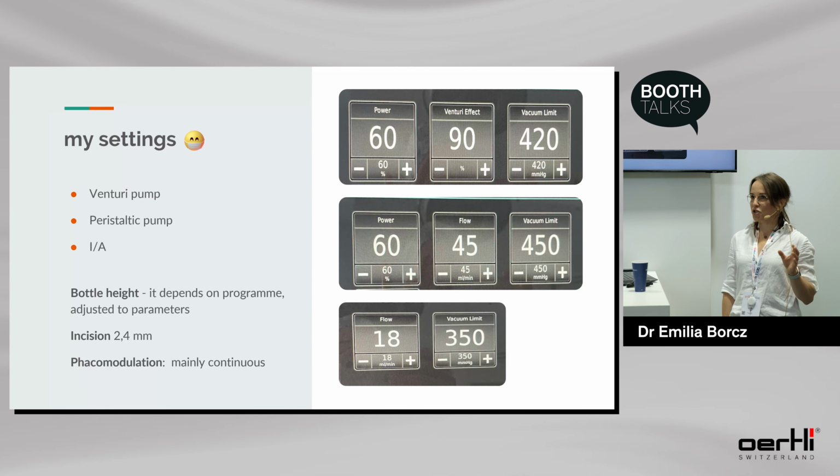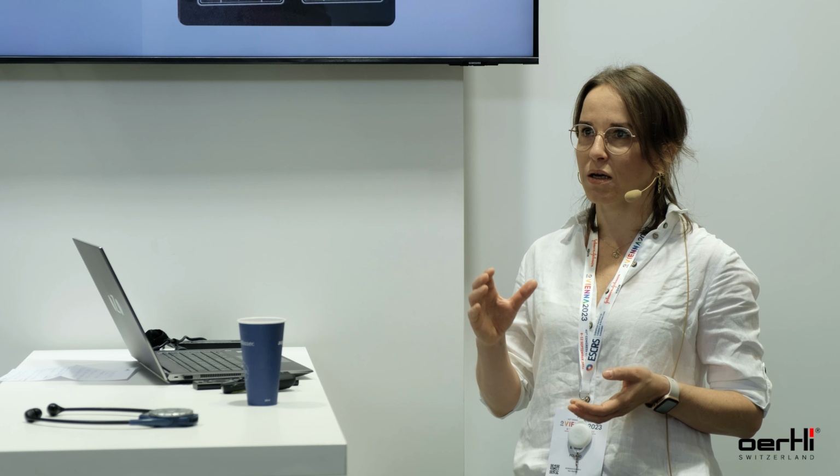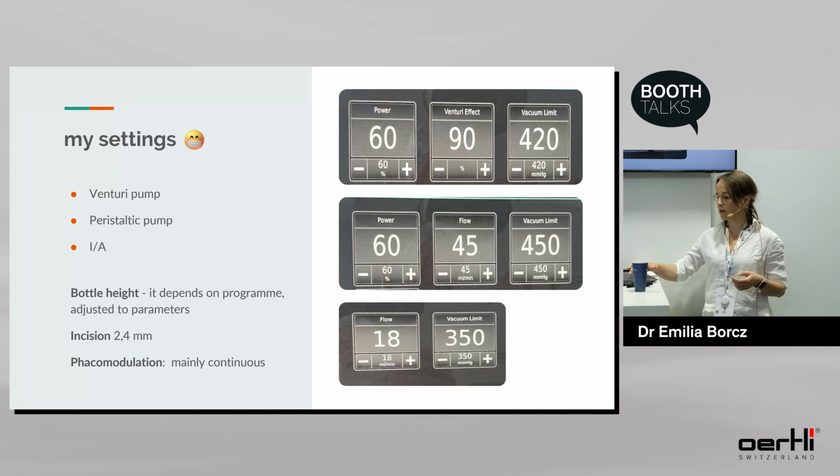The bottle height I adjust to the situation, to the program, to the lens. For sure, the intraocular pressure is not too high. It does not destroy endothelial cells, but is good enough to protect from collapsing. I mainly use the incision 2.4 and use phaco-modulation mainly continuous. I used to use pulse and burst. I played with this, I changed all the time. But right now I think that continuous is more comfortable. With very nice working of the foot pedal, I can beat my own rhythm of the ultrasound, so it's fully controllable.